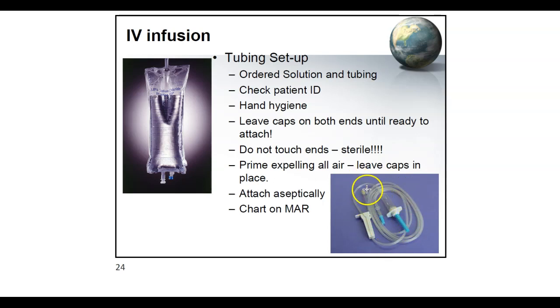They will if they have any sort of caps. So the caps here and the caps here. Make sure it stays in there until you're ready to attach it. It is easier to keep them clean and aseptic rather than opening it, and now you can't really put them down and you are running the risk of touching it against something or touching it with your own hands. So keep this until you're ready to connect it. Anyway, do not touch the ends. If you remove the caps, it is sterile.